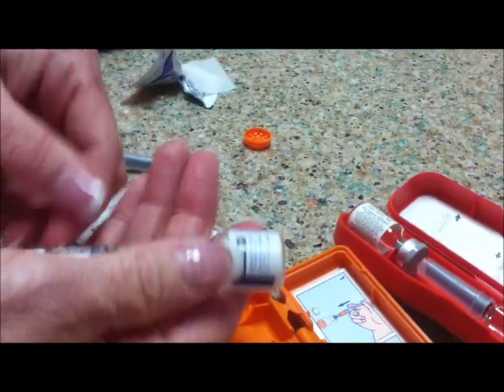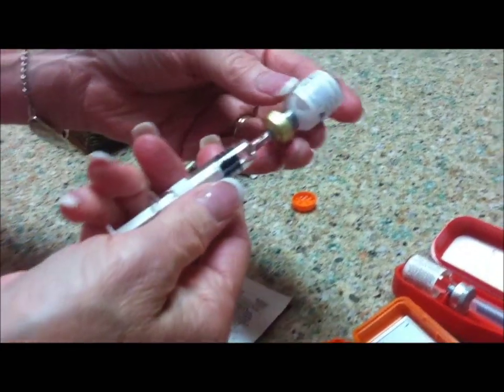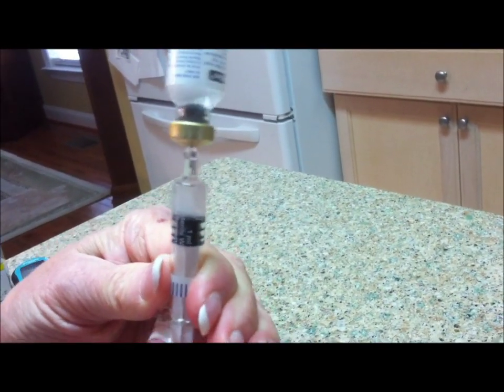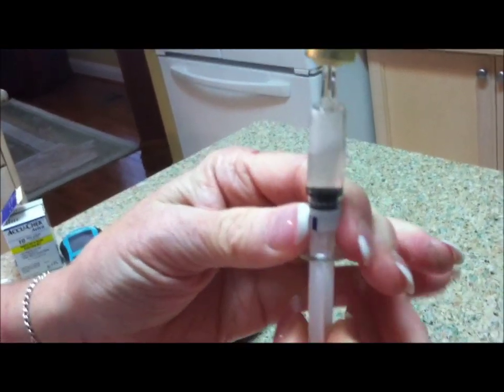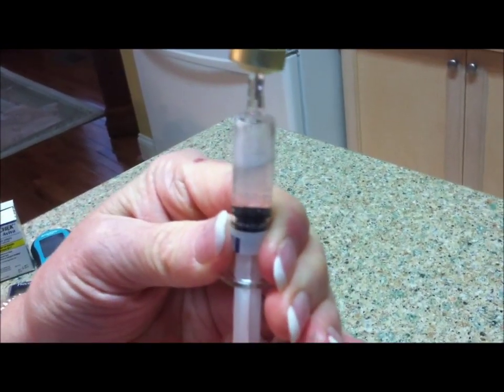I usually hold this and shake it — hold it together like this and turn it around a little bit so that it is completely dissolved. Then we're going to withdraw all of it. Anyone over 20 kilos gets a full 1 milligram, and anybody below 20 kilos would get half a milligram.